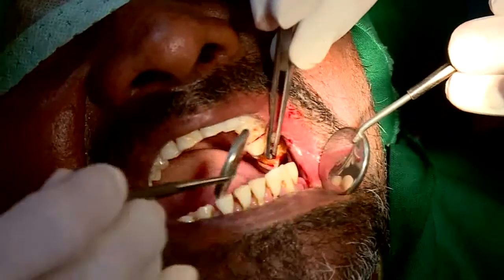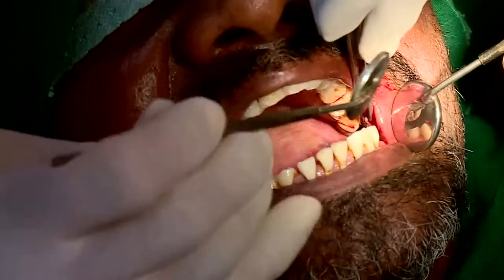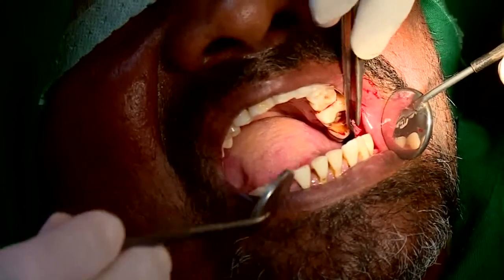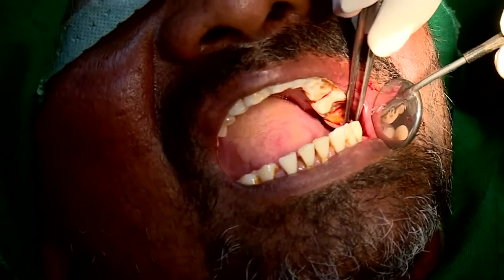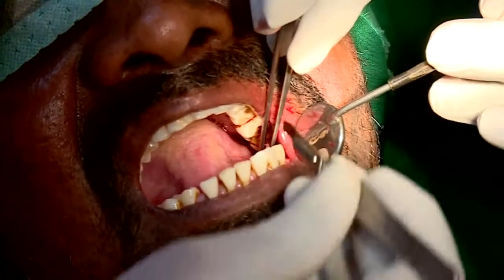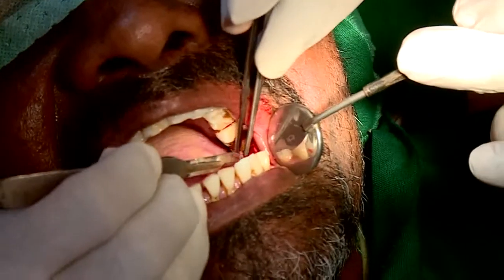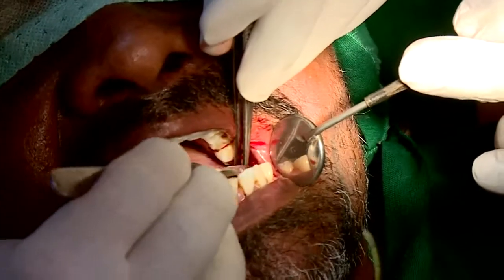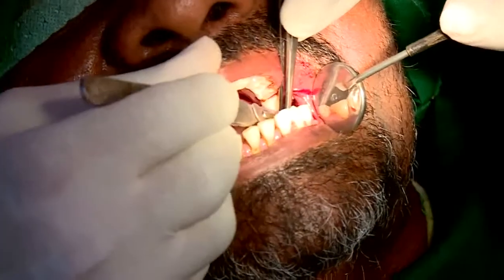Yeah, we can see that. So that's the specimen which contains mucosa, normal mucosa, and the fibrous tissue until the muscle layer. So now the last cut is going to be the base cut. I am trying to pull it a little from the base and make the cut at the base of the lesion.